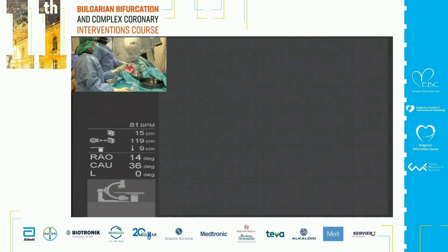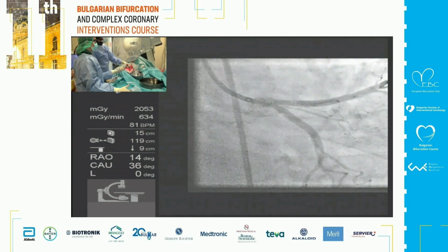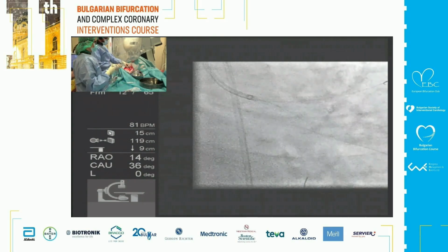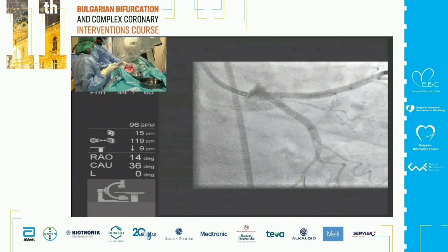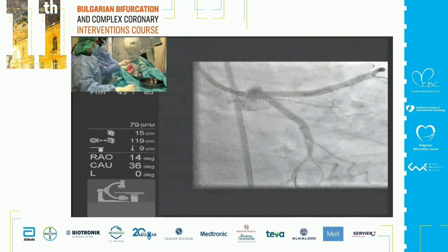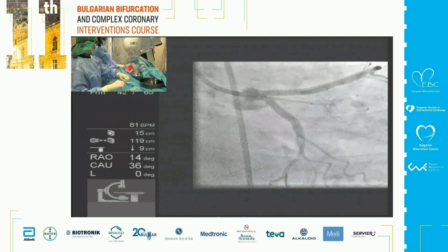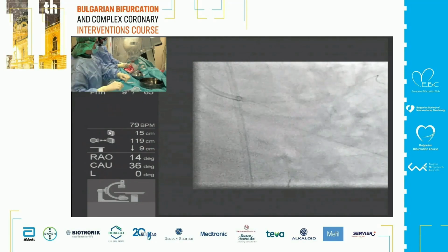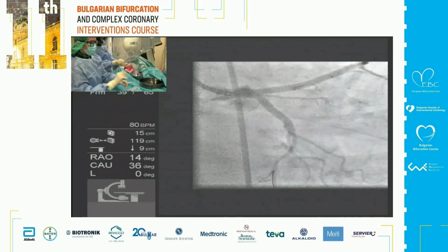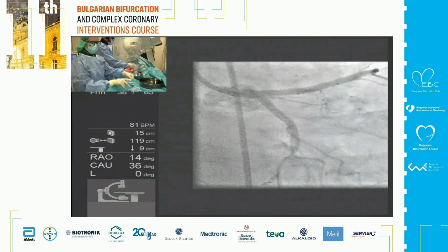Okay, a good cine. Wow, what a beautiful case. Okay, should we go for an IVUS? I would like to, but if you have no time or if you consider this is good. I do have time. We have 13 minutes, so I think 13 minutes are enough for IVUS. Yeah, it's enough.